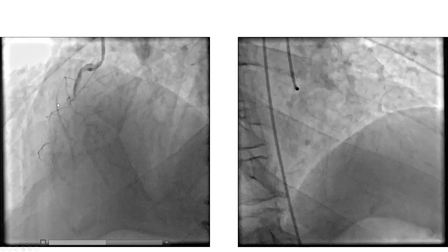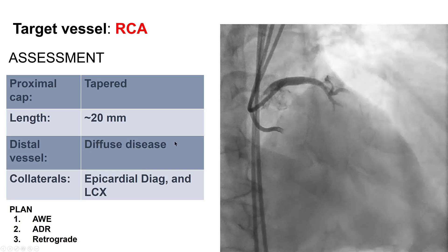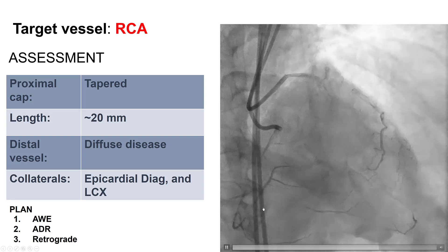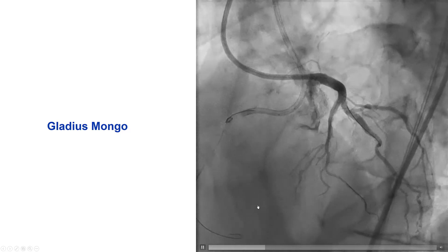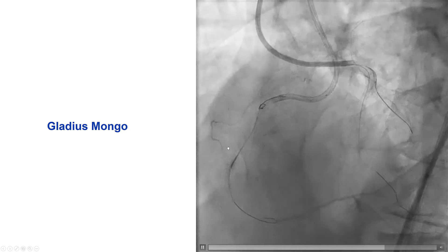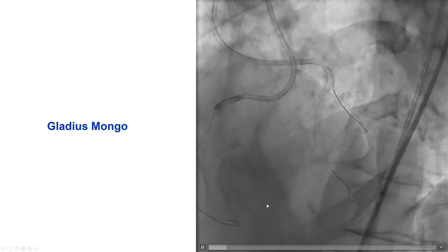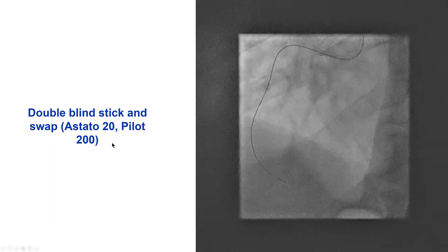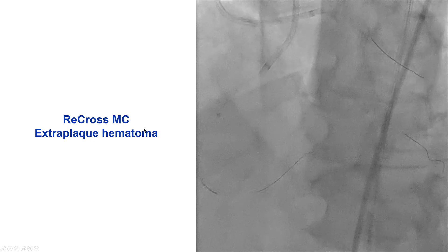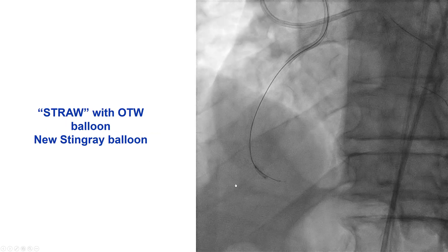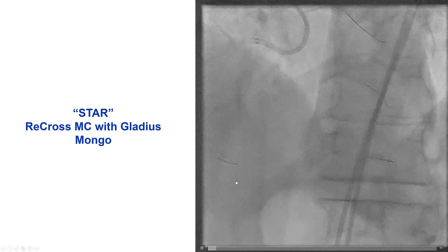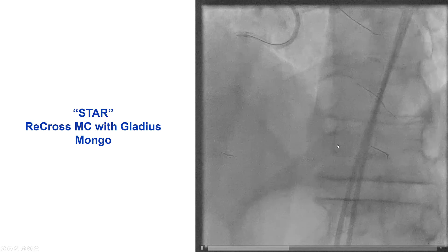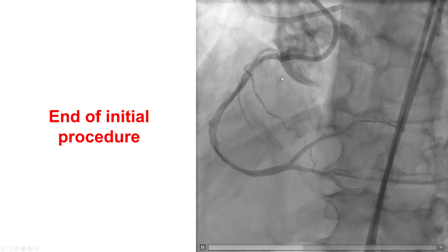There is the RCA, a diffusely diseased vessel. The patient underwent a percutaneous coronary intervention attempt that was outlined in detail in video 181. The right coronary was approached with an ADR. There were multiple attempts for re-entry using various systems, including the stingray balloon as well as the recross microcatheter, and despite using the straw technique and other techniques, it was not successful. In the end, we performed the STAR technique with the Gladius Mongo, and this is the final result.